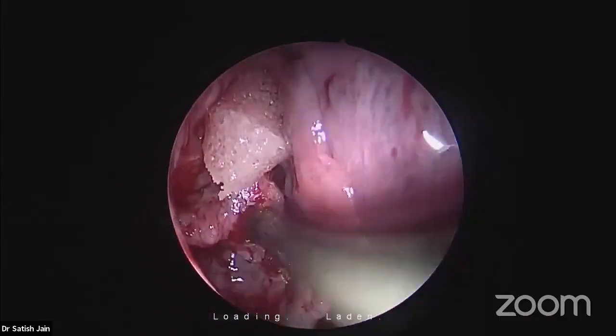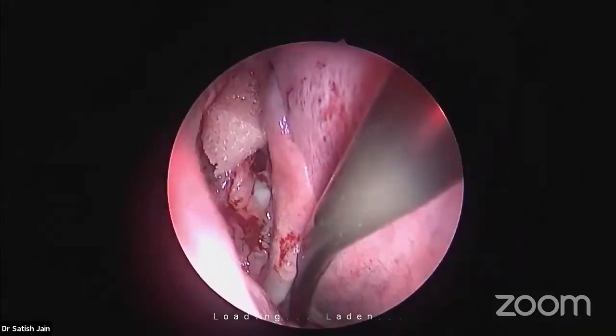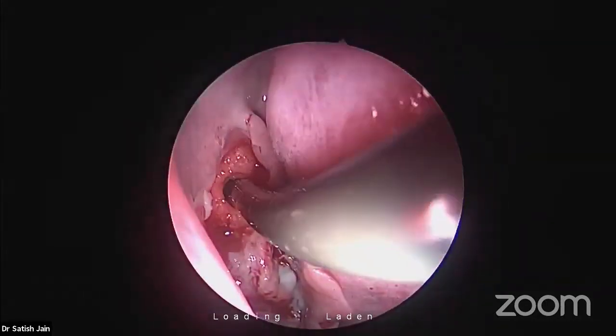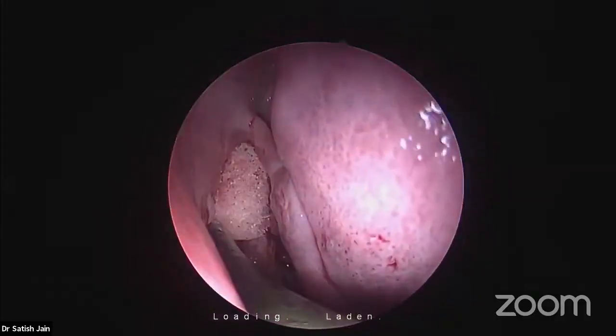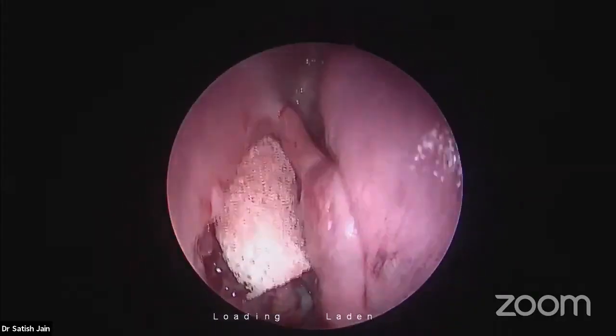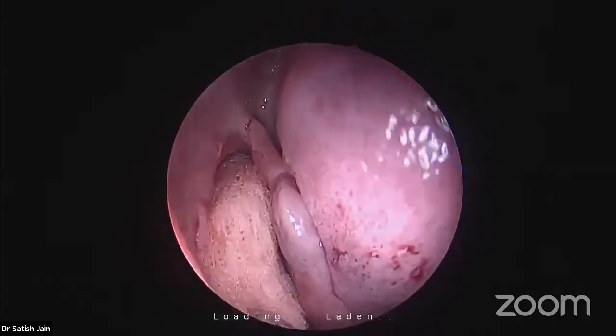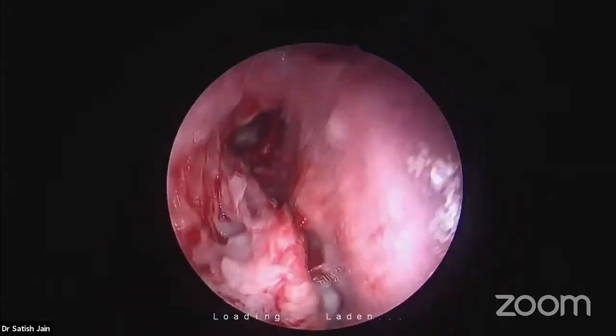You need to see on CT scan whether there is a suprabullar cell. Your anterior ethmoidal artery may be more exposed to be injured.